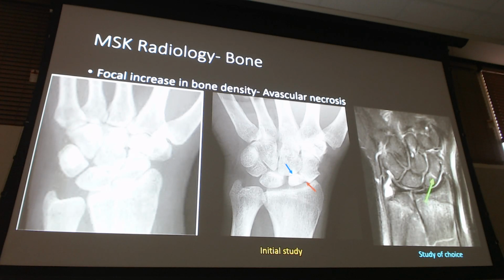This patient's likely going to get surgery. But that's why that MRI can make that scaphoid fracture pop. We don't normally use MRI for fracture evaluation, except in the case of avascular necrosis. Even if we couldn't see the fracture, if this was starting to sclerose, starting to die, we would have increased signal, so it would be brighter white also in the scaphoid. So we may not see the fracture, but we would see increased whiteness from the MRI somewhere in that bone. And that's really why we jump into the MRI as a study of choice.